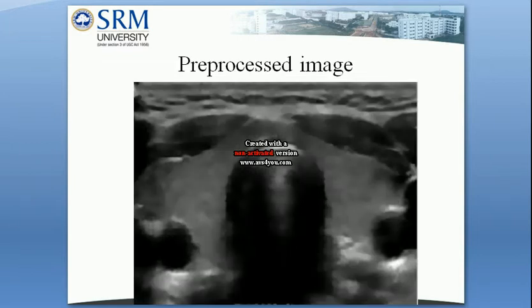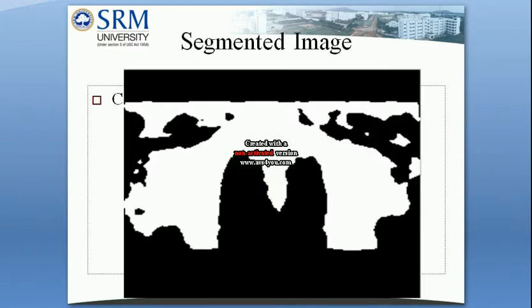This is the pre-processed image. Here principal component analysis is used as a pre-processing step. This will convert the multi-band to a single band, where PCA is used to reduce the large dimensionality of the data and for multispectral band reduction. Hence it is useful for discriminating the patterns of different signals with limited features. So the band reduction is used to explain the majority of the variability compared to multi-band features.